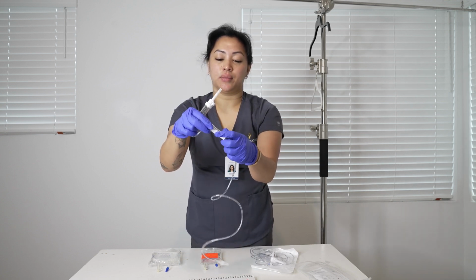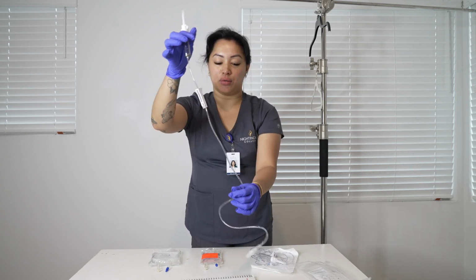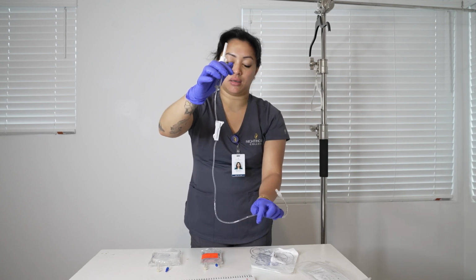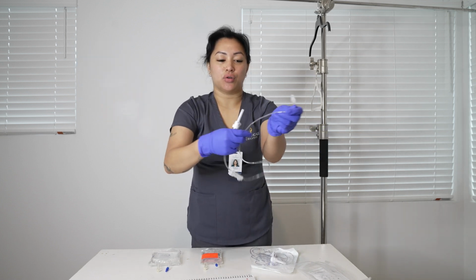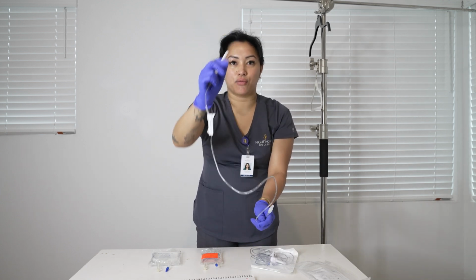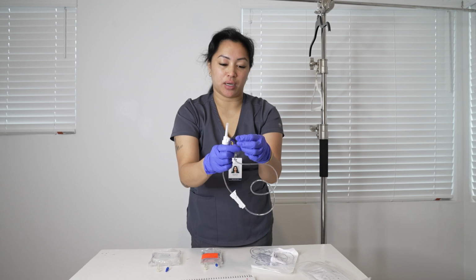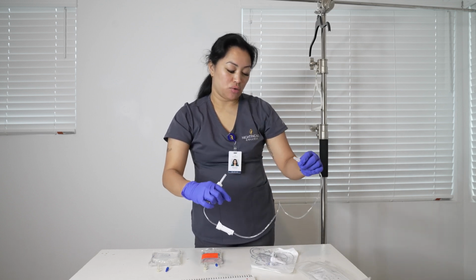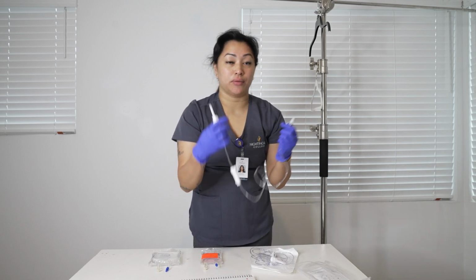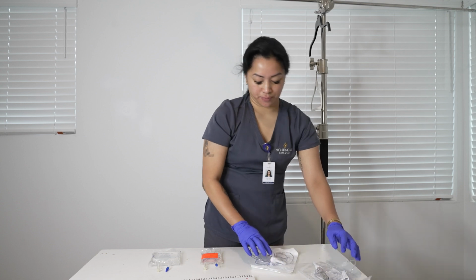The roller clamp, roll down all the way to make sure that the medication does not leak out. And you notice right here there is no Y port, since this is for the medication. No Y port. That is the difference between the primary and the secondary. And here is the adapter that you will put into the Y port for the primary. Alrighty.